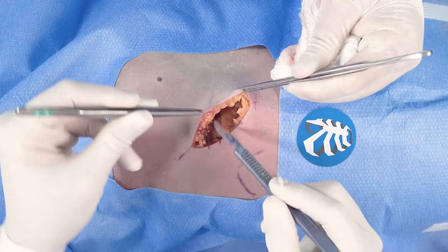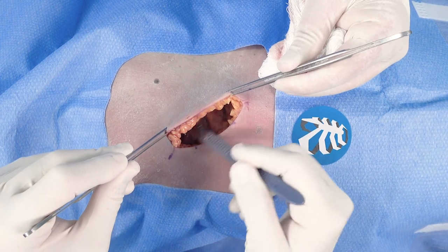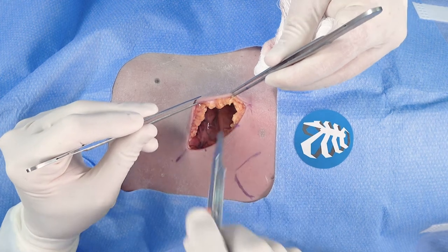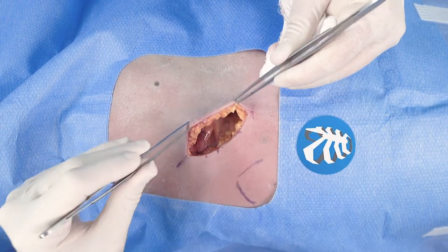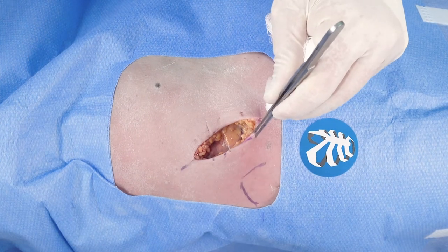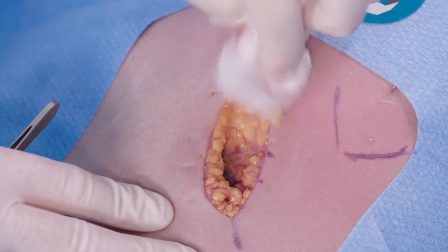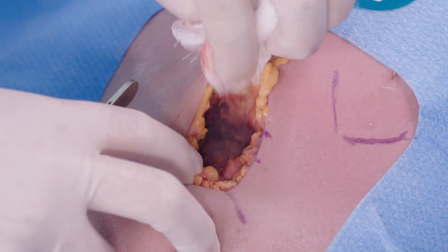Dr. Christie, are there any vessels or nerves in this plane that you should be concerned with, or can you proceed in an unbridled fashion? You can be unbridled — in the subcutaneous plane, there's absolutely nothing to worry about. We will run into some structures that deserve mention in a little bit, but right now this is just elevating skin flaps to create our keyhole window.